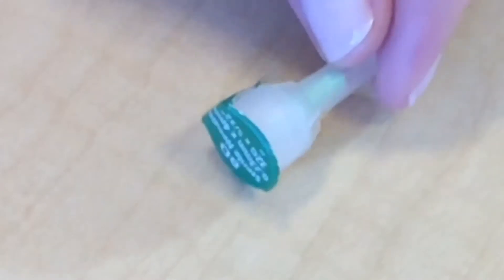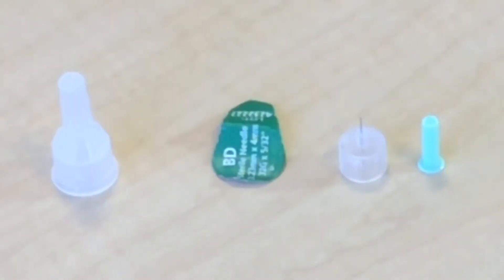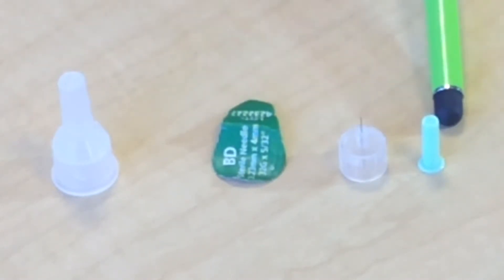This is a pen needle, and here are the parts of the pen needle. The different parts of the pen needle are the outer cap, the safety covering, the inner needle, and the inner cap.